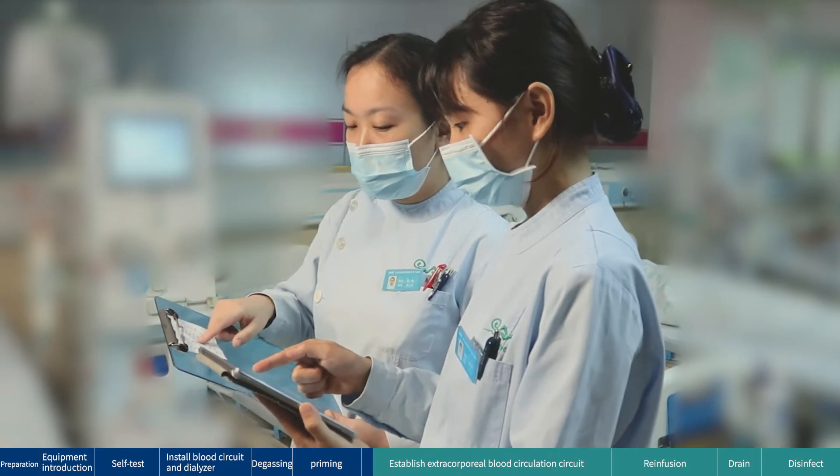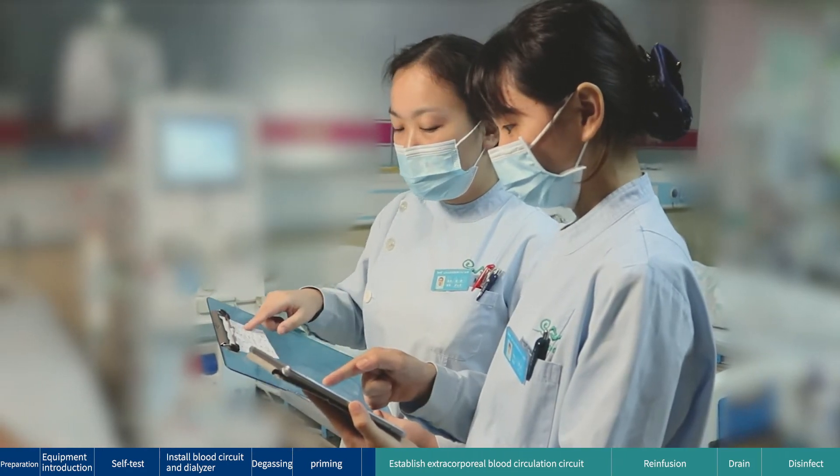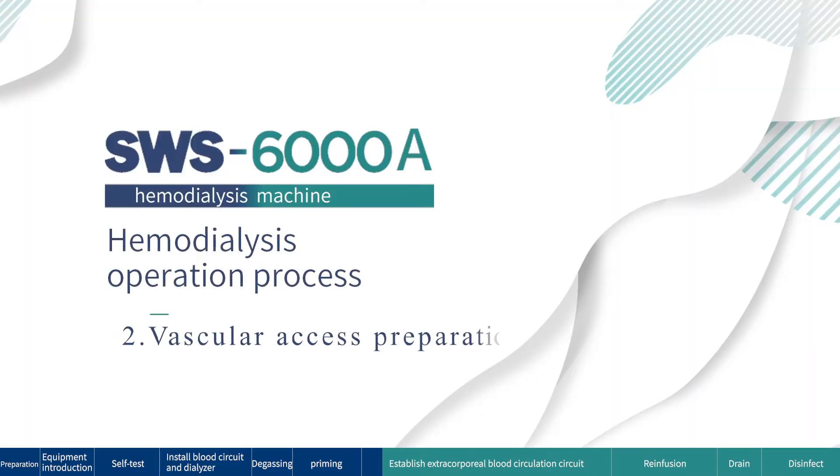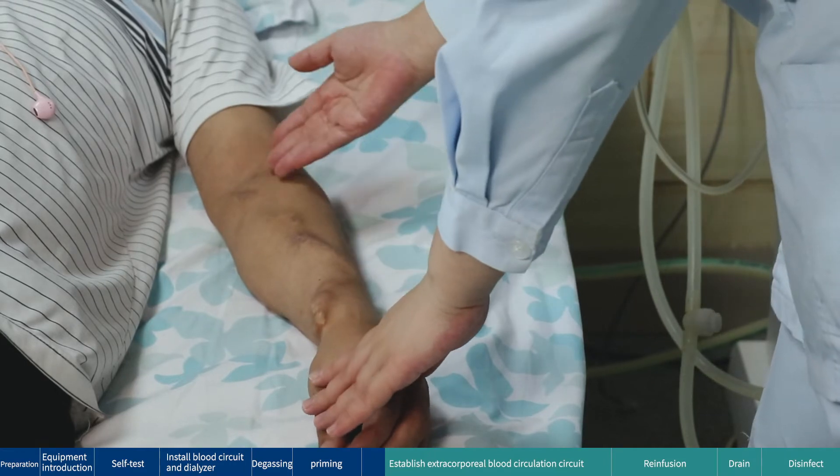First check: check the doctor's orders. Second: vascular access preparation.